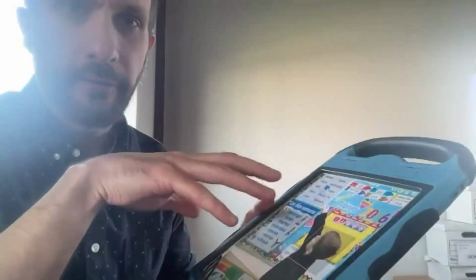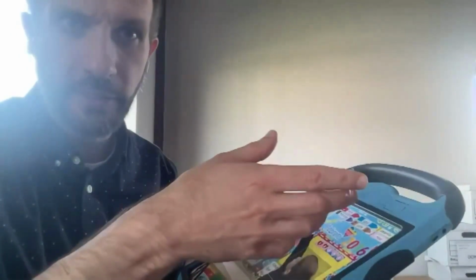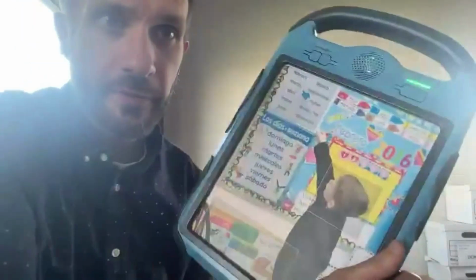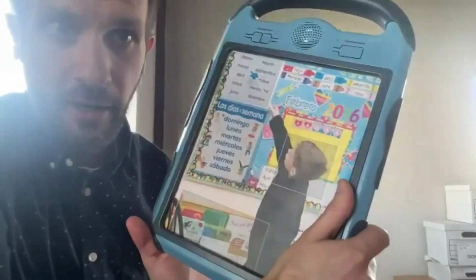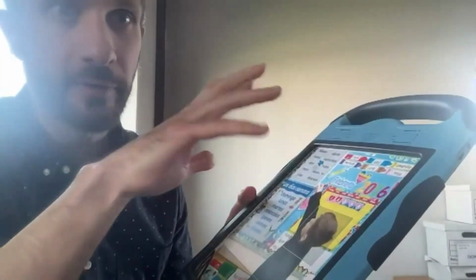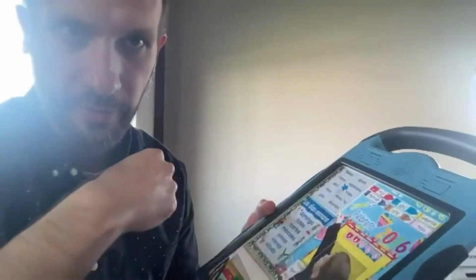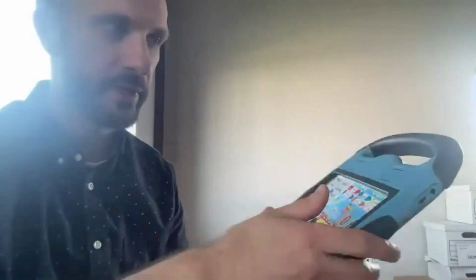For those of you who are unfamiliar, visual scene displays are an alternative method to the traditional grid-based AAC that we're familiar with. For some individuals, visual scene displays can be a better fit. Typically, they use an actual photograph, and oftentimes it can be a photograph of that student's classroom or of their family and friends. So it's a little bit more relatable, and there's not as much of a cognitive leap to get to these abstract symbols. It is just another alternative that can be used.